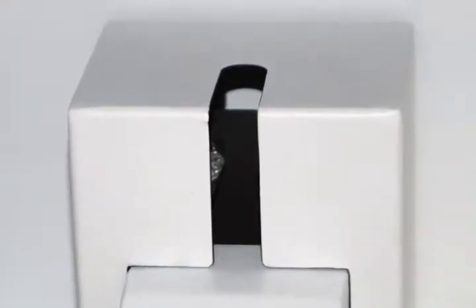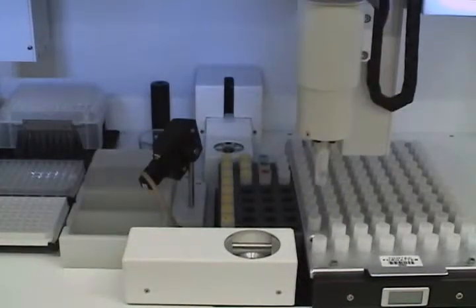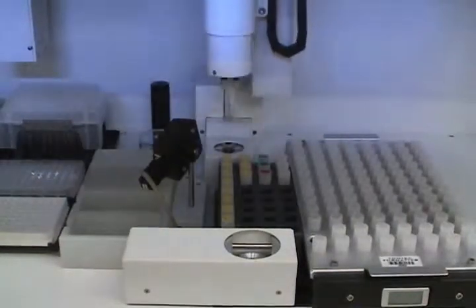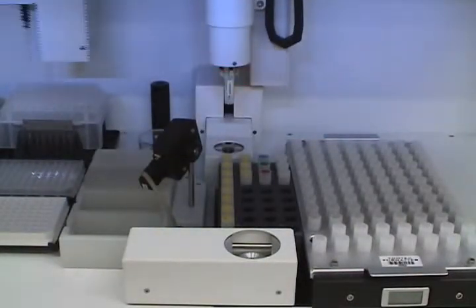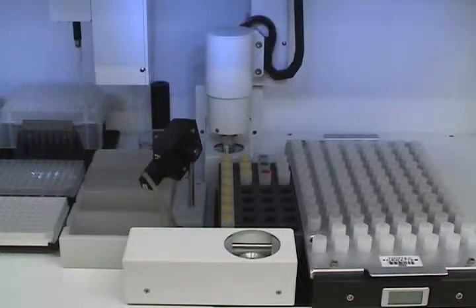The accuracy of pipetting is determined by the pipetter, not the meniscus detector. The meniscus detector simply looks at the meniscus in the tip. Is the volume visually correct? Was the tip occluded by a clot that prohibited aspiration of the correct volume? It is not a precise volume check.